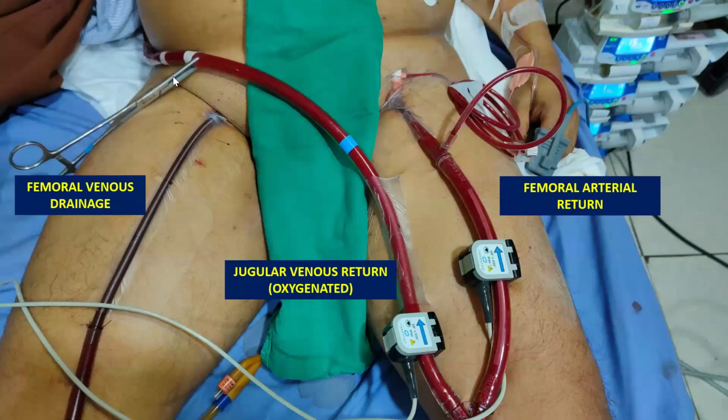Why this clamp? The venous return that we are giving goes against a lower pressure than the arterial line. So if we are not clamping it, all the flow will go there, and we will not get any arterial circulation going. So for that, we put a clamp.